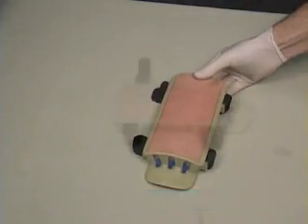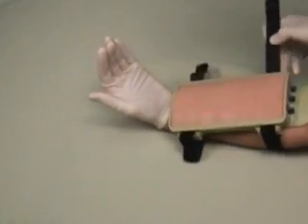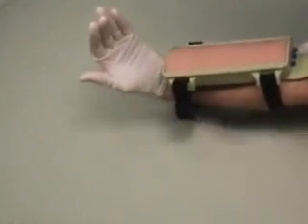The tissue holder is also equipped with two Velcro straps so that the tissue can be attached to a person to simulate the interaction with the patient as well as the procedure.